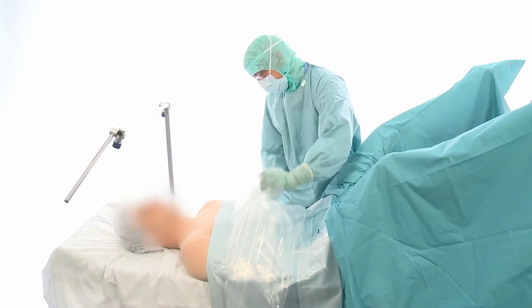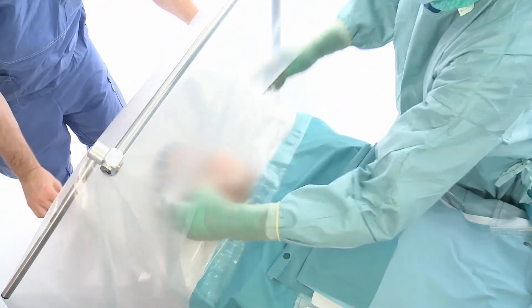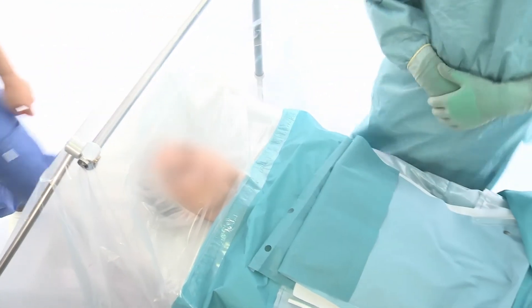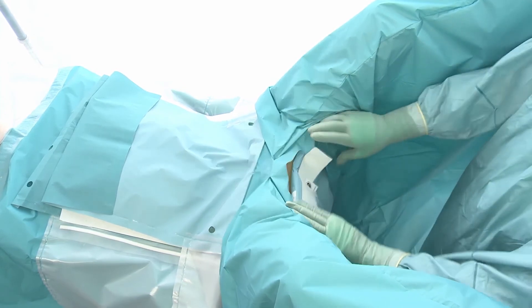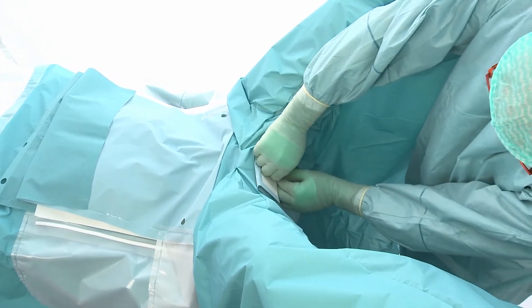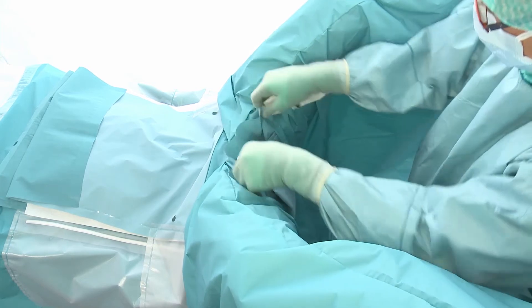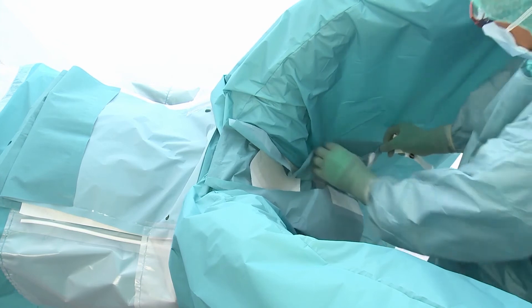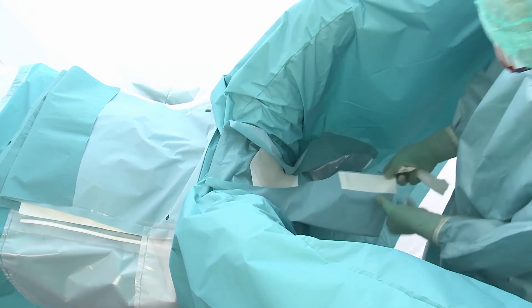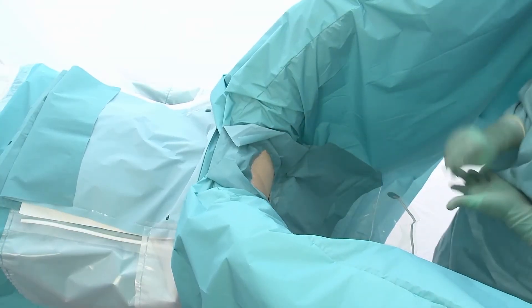Unfold the drape fully towards the head. Open the perineal drape through the perineal aperture. Remove the release papers and secure the drape to the laparoscopy drapes. Once the crepe paper is removed, ensure that the adhesive film is securely attached to the patient.